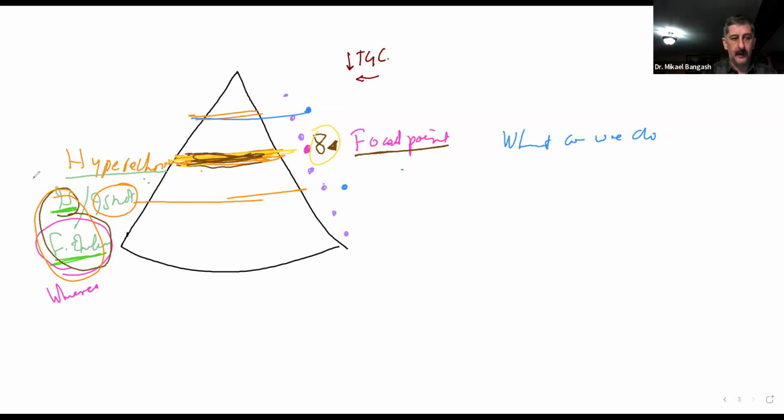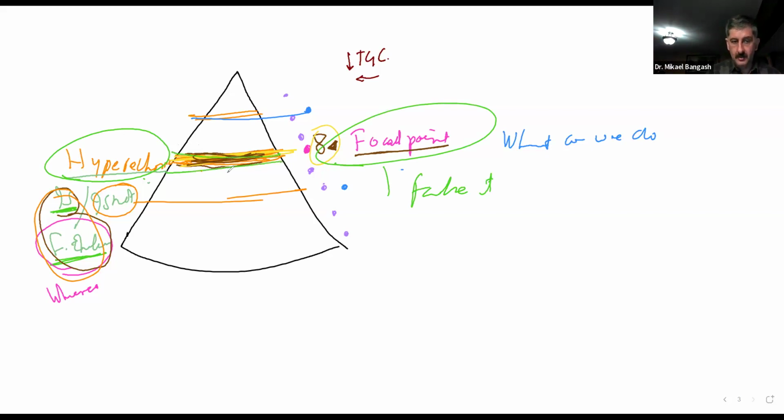Right, as we said earlier, how to fake it, or fakely produce something that may mimic or look like a hyperechoic reflection across, or horizontally across your scan, could be mainly by increasing the TGC at the depth.